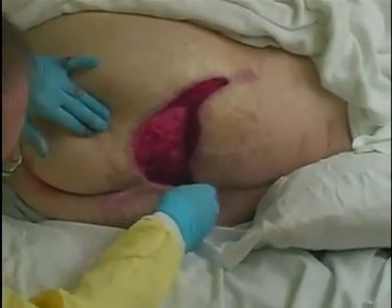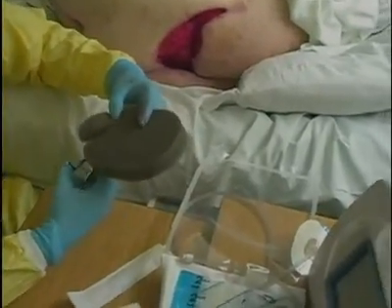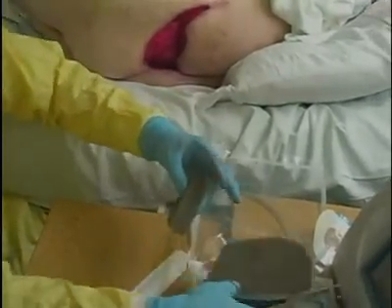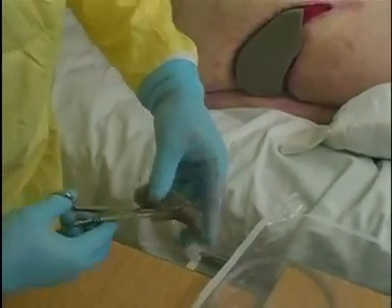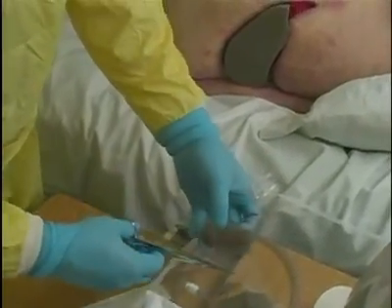Cut the foam to the dimensions that will allow the foam to be placed gently into the wound. Note, do not cut the foam over the wound. Gently rub the freshly cut edges of the foam to remove any loose pieces. Also, do not pack the foam into the wound.